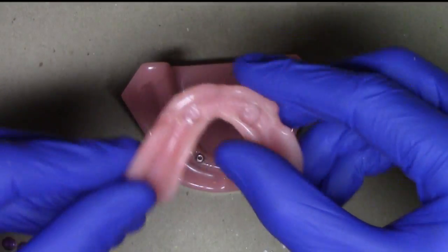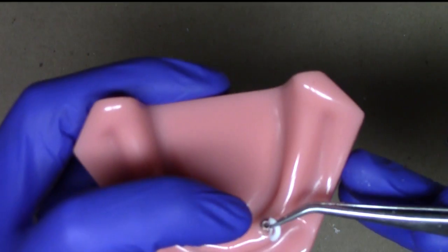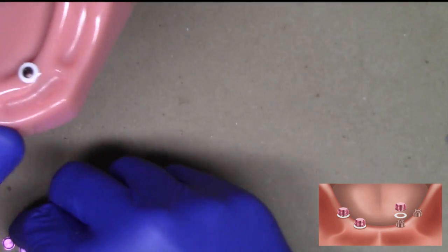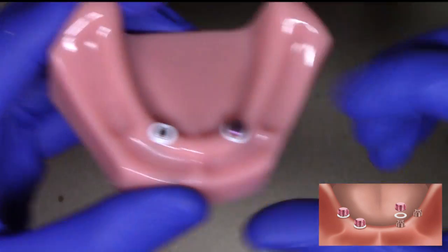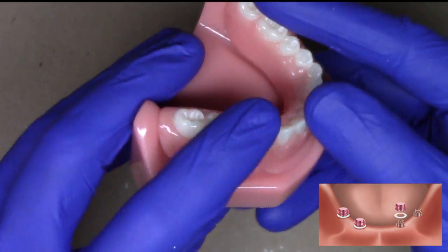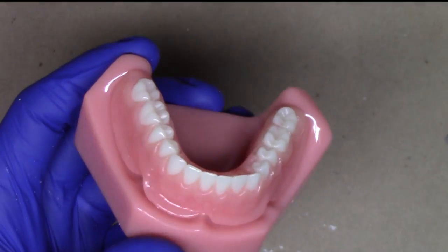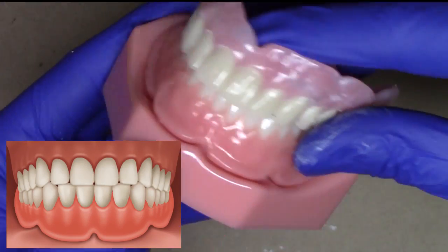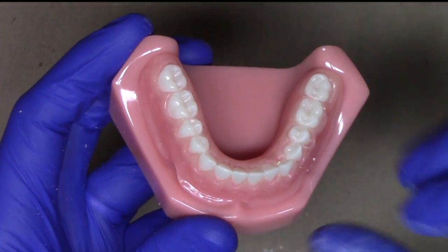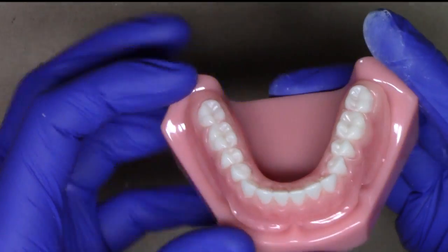Now I've got my recesses properly sized. I'm going to place back on my block-out spacers and also my housings. As a safety check, I take the patient's denture, place it back onto the ridge, and verify there's no rocking. Since I'm also doing a reline procedure, I want to verify that when the patient bites down there's even occlusion all the way across. The vertical dimension should also be matching approximately what the patient had before. I instruct the patient to make sure they bite down lightly, and we practice that a couple of times.